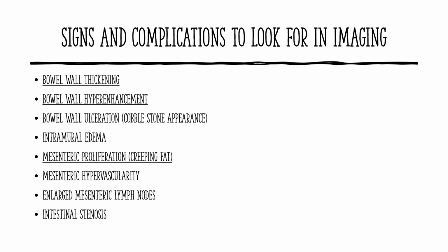There are some other signs as well that we will not focus on, but mesenteric proliferation, also known as creeping fat, is something that can be seen on a CT scan, and it will enhance the CT images as a definite sign of Crohn's disease.